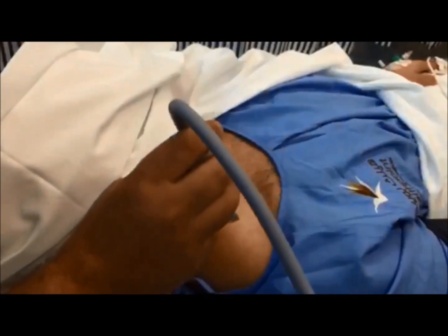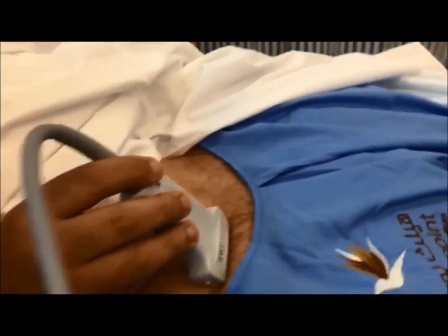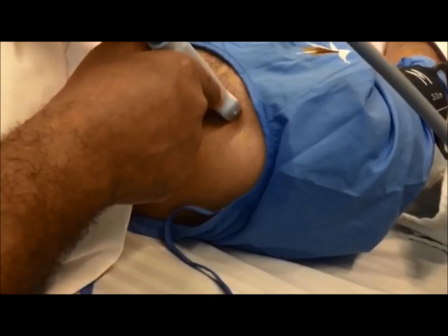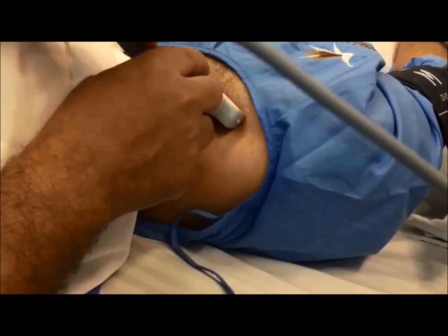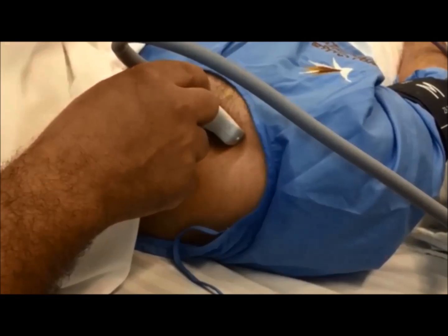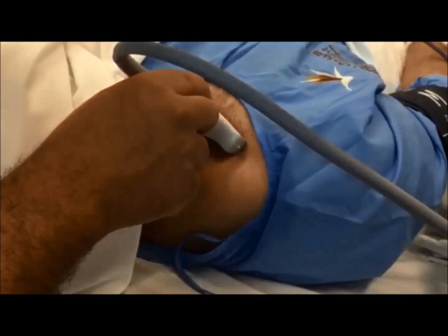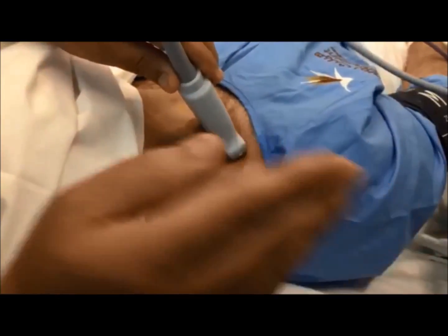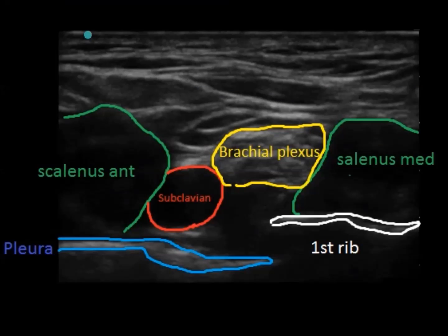The probe is placed first in the supraclavicular fossa and aimed caudally. We want to identify the subclavian artery. Once you identify the artery, the brachial plexus is just above and lateral to the artery — it lies superficial and lateral to the subclavian artery. Both the artery and the plexus lie between the scalenus anterior muscle medially and the scalenus medius muscle laterally, with the pleura and first rib lying deep.